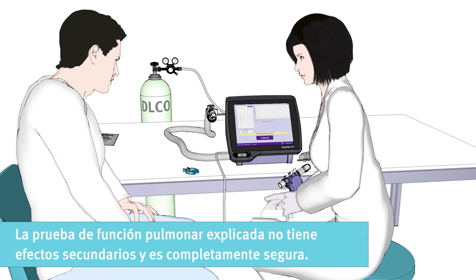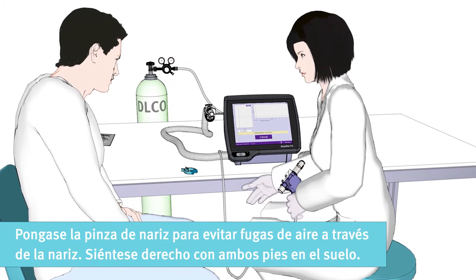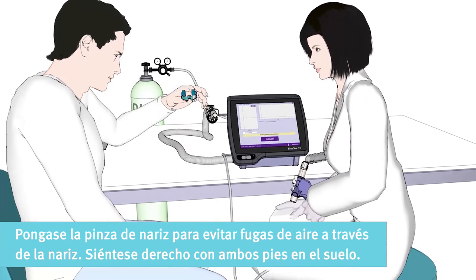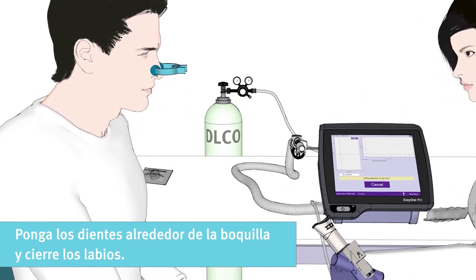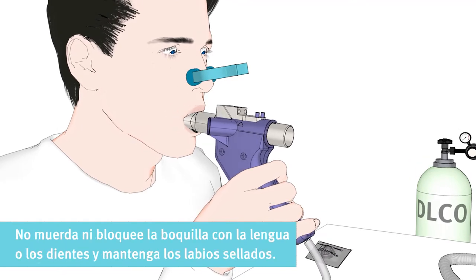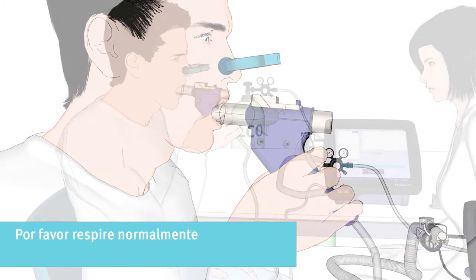The lung function test does not have any side effects and is completely safe. The nose clip is important to make sure that no air leaks through your nose while performing the test. Please sit up straight with both feet flat on the floor. Place your teeth around the mouthpiece and close your lips. Do not bite or block the spirometer with your tongue or teeth, and keep your lips sealed.